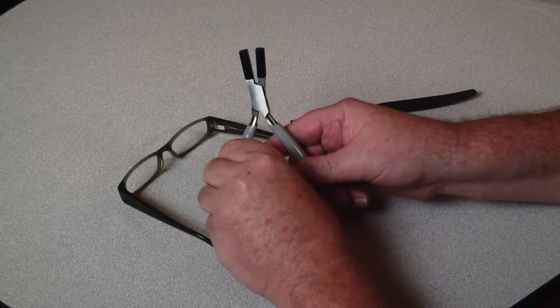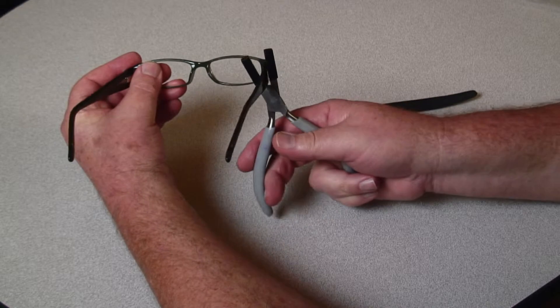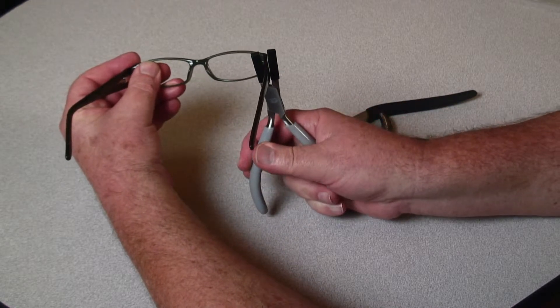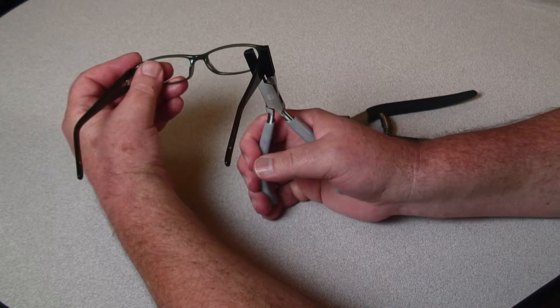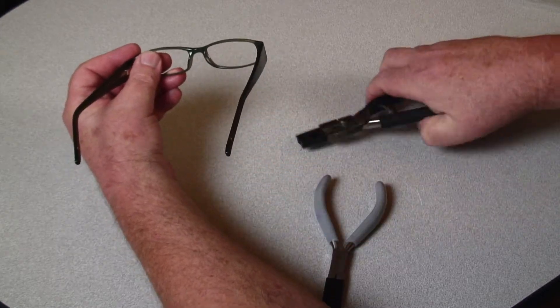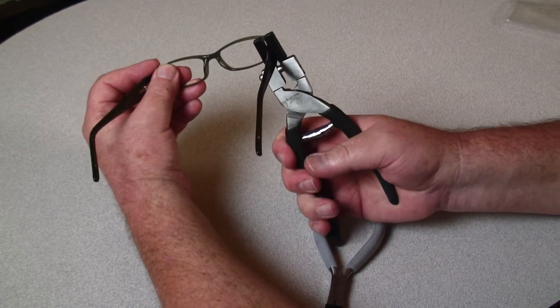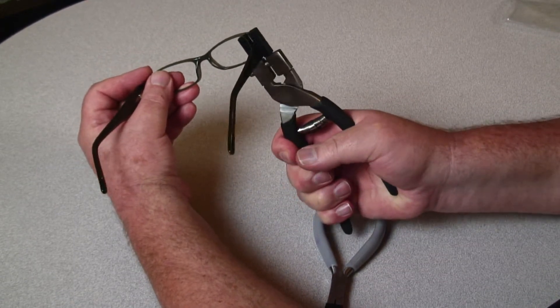Conventional pliers open and close with a scissor action, so only the bottom of a thick temple is grabbed, forcing you to squeeze harder and potentially mar the frame. Using a parallel jaw plier, you are able to grab the entire temple securely without any risk of damage.